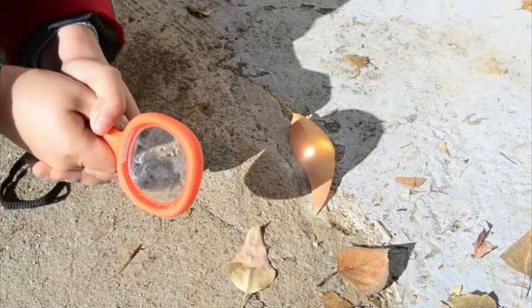A good analogy for this is a magnifying glass and how it focuses the rays of the sun in a small area to create an intense amount of heat. And if you don't get that focus right on the object you're trying to heat, it really doesn't do anything to it. It doesn't cause any harm, doesn't generate any heat, but if it's right in the focal area, it can actually light things on fire.